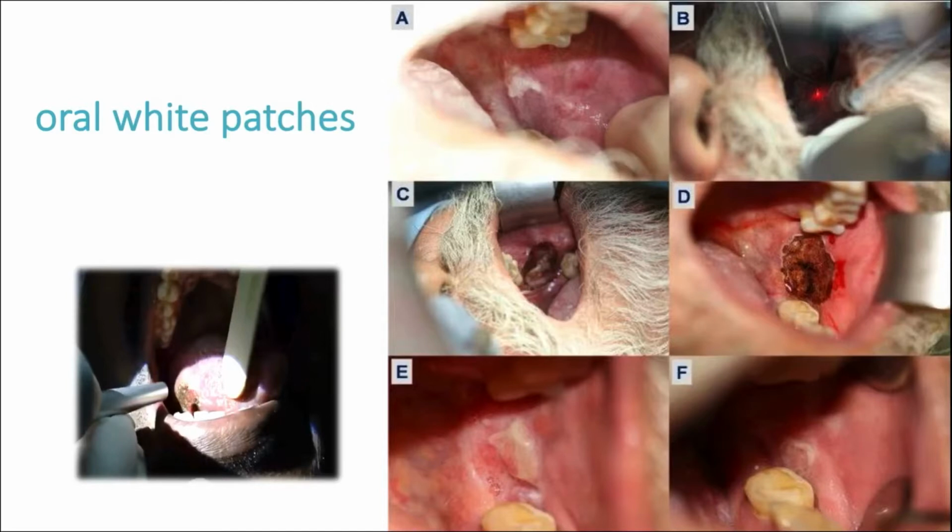Healing following resection of benign lesions is excellent. However, with pre-malignant and malignant lesions, follow-up for many years is necessary to determine the rate of recurrence and the stability of the new epithelium after laser treatment, as well as to obtain comparison with the conventional form of surgery.